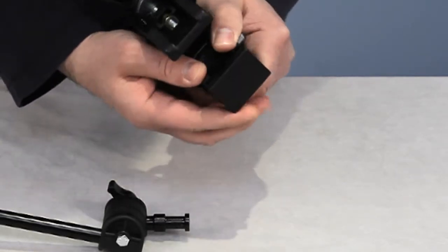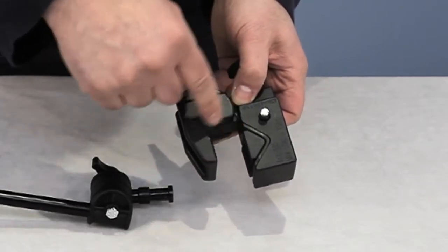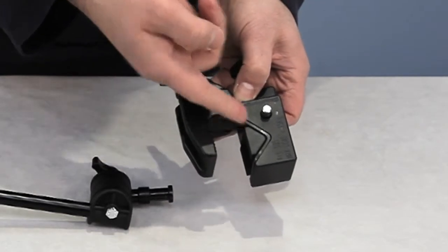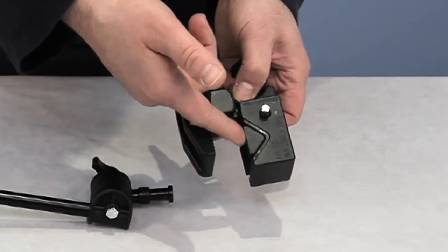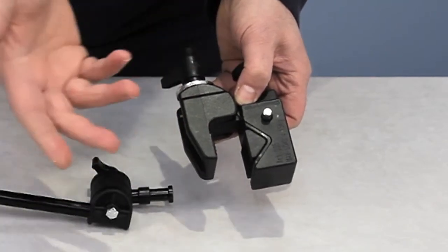This just press-fits in. With this wedge in here, this gives you a really great flat surface for mounting on flat surfaces like a tabletop. This also has a no-mar finish inside — a protective coating — so that you won't scratch your table, furniture, bed rail, or wheelchair.